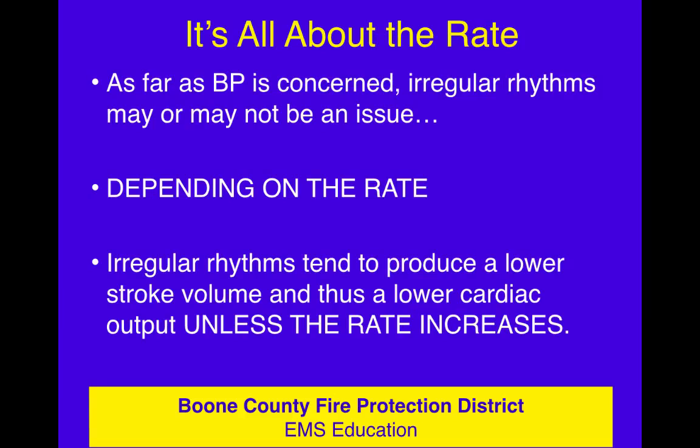So, is this a big deal? Should we be concerned? Do we really care about P waves and QRSs? Well, yeah. As far as the BP is concerned, irregular rhythms may be an issue because of the lack of synchronization between the atria and the ventricles. It doesn't get the ventricular stretch, a little bit of a decrease in stroke volume, which causes a cardiac output problem, which causes a blood pressure problem in some cases. But other times the irregularity is just kind of entertaining. It's just not scary. But it all depends on the rate.